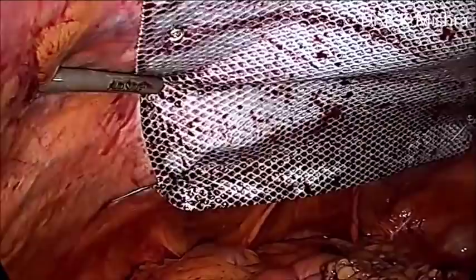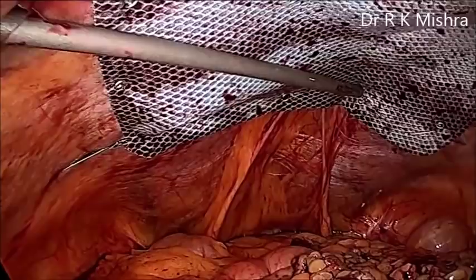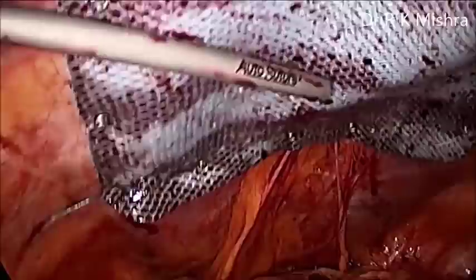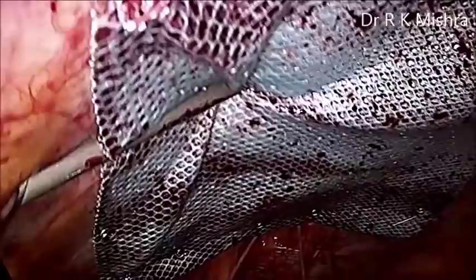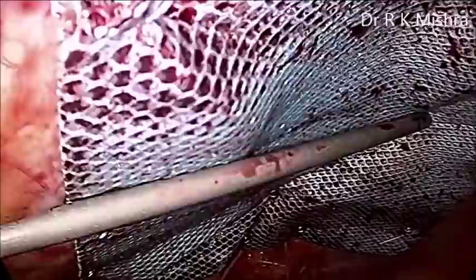You can see here these are the two medial umbilical ligaments which are visible, and you can apply on either side. But do not go very lateral to the medial umbilical ligament because there will be the inferior epigastric vessel. For the inner crowning, care should be taken that the tacker should not be fired over the defect directly, because at the level of the defect only bare thin skin is present and it can prick through the skin, increasing the chances of infection. Fire the tackers on the margin of the defect so that they will not come out from the skin.